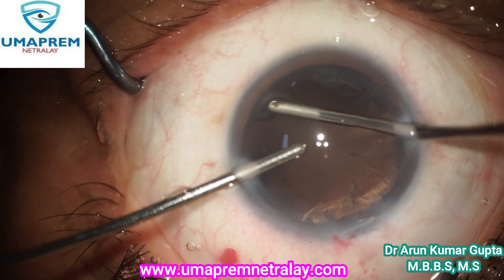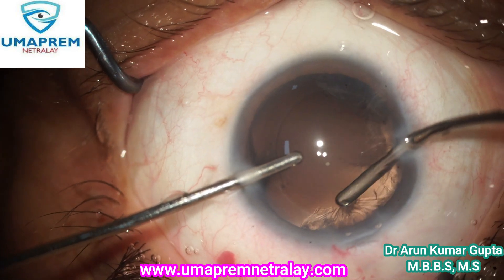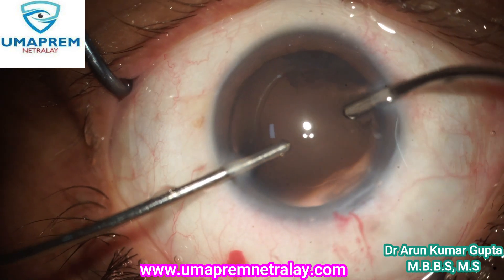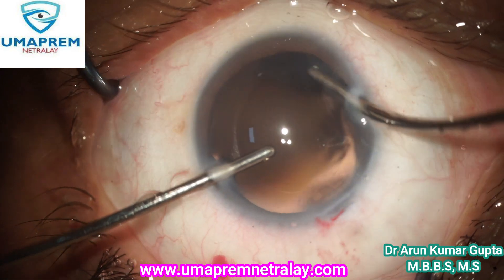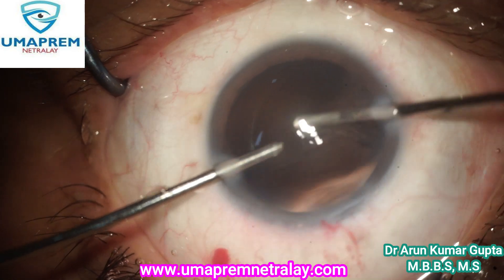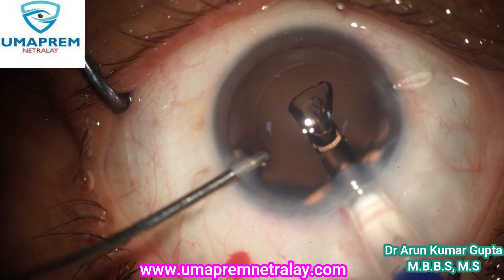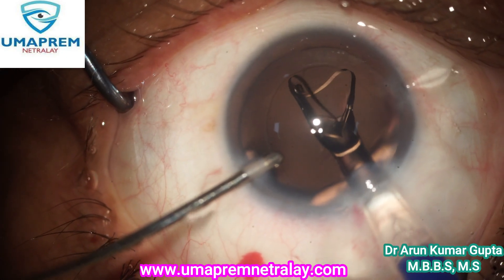After phaco emulsification, irrigation and aspiration is done. See the clarity of the cornea, and under hydro implantation.